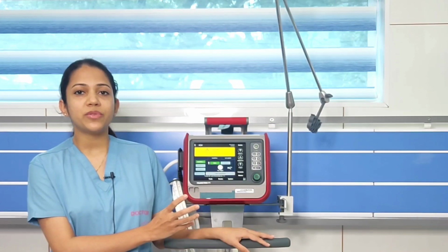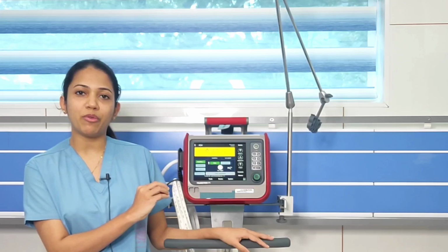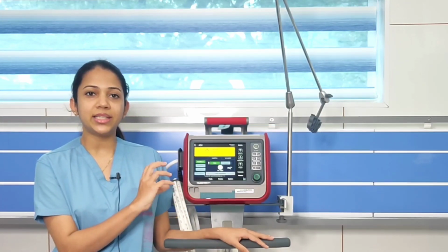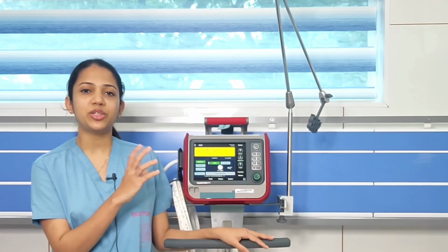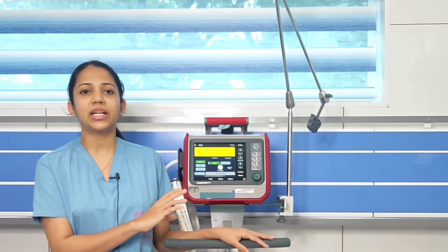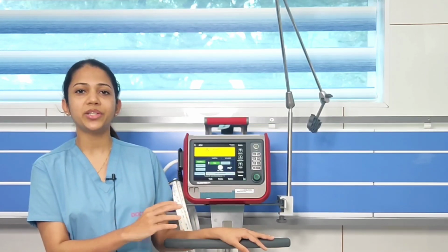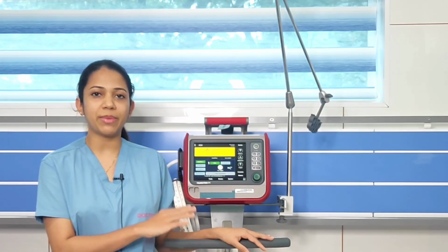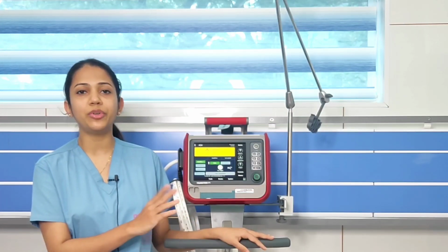Depending on the respiratory rate we are setting, the ventilator will provide the breath to the patient. Suppose we are keeping the respiratory rate as 12, so the ventilator will provide a breath every 5 seconds. So that is a time triggered mechanism, and it depends on the settings which we are providing. The disadvantage is, since it is not sensing the patient's trigger, it is not very good for weaning the patient. Some other trigger mechanisms are pressure trigger, volume trigger and flow trigger.